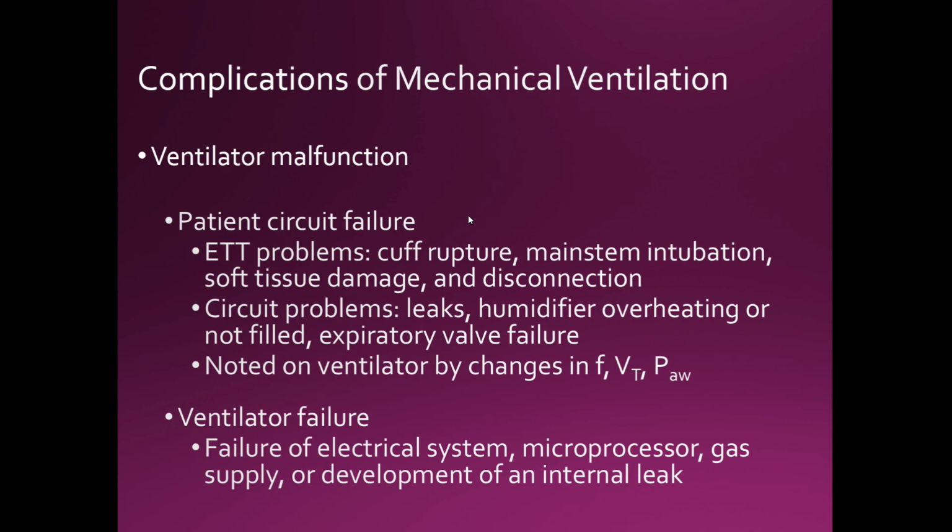Circuit problems, you might have a leak in the circuit. Maybe there was a cover on the temperature port on the inhalation limb of the circuit, and now it's gone, so now you can't hold that pressure. You have to change out the circuit. You have a humidifier that overheats. That's going to be a really bad situation, because now you are burning the patient's lungs. Or the humidifier is not filled up with water, so therefore you're not humidifying, and the secretions become thick, tenacious, and copious.